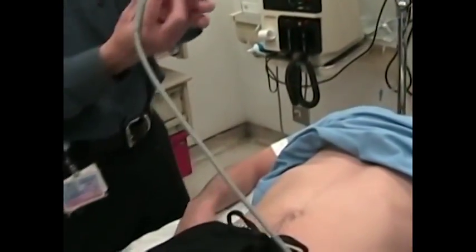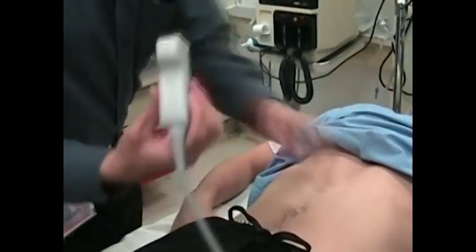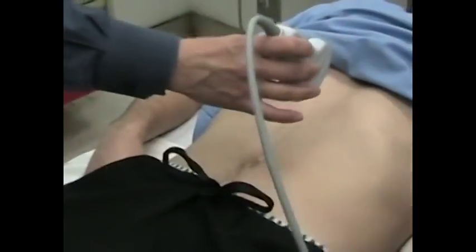My name is Daniel Duquet, the ultrasound director at Elmhurst Hospital Center. And I'm going to be demonstrating the proper technique to visualize the inferior vena cava.